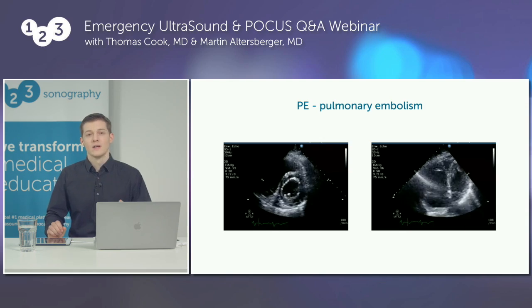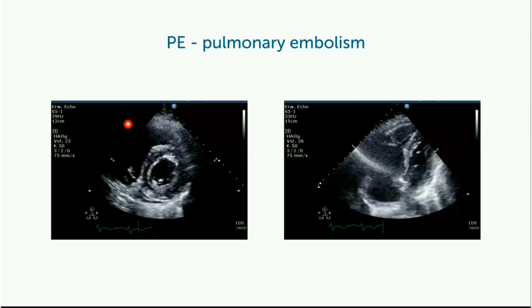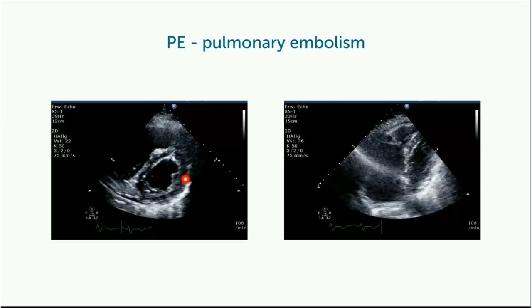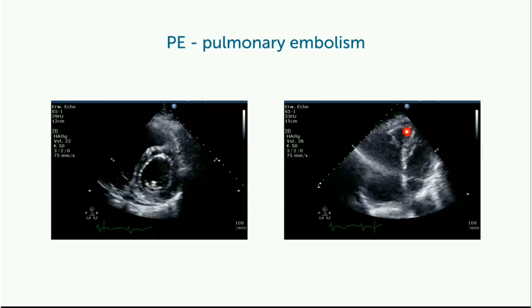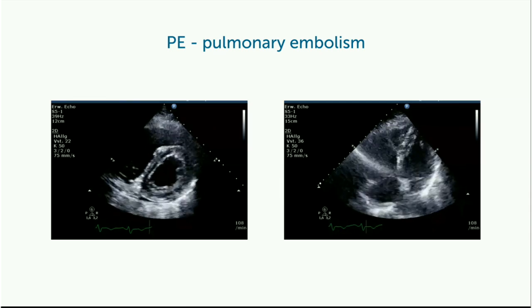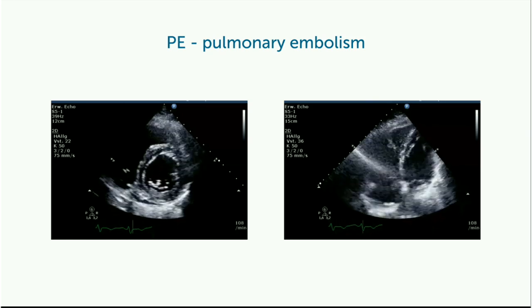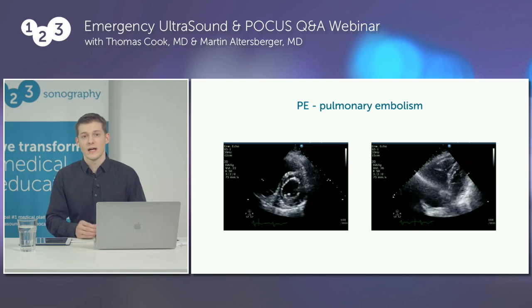To move on, to explain quickly the pulmonary embolism, what can you see here? You see the large right ventricle over here and a D shape of the left ventricle. The same you can appreciate here in the four-chamber view again. It's a large right ventricle compared to the left ventricle, which is rather small. And especially again here, be aware of this D sign. So that's a rather quick and easy way to see a pulmonary embolism. But be aware, also in a chronic state of higher pressure, the D-shaped ventricle could be present. Of course, the right heart is also dilating.